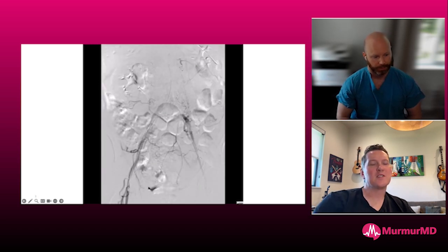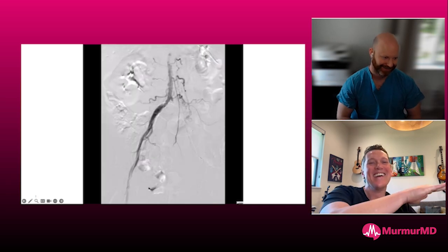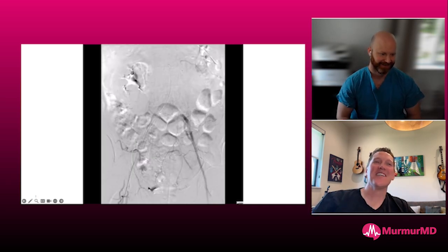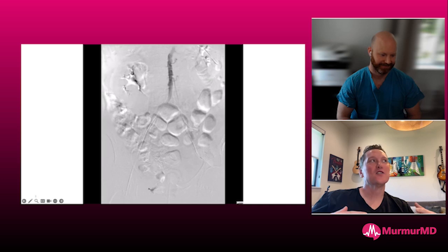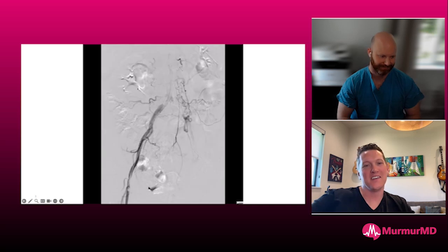Some people in total extremis, you put that thing in and it's like their heart's just like, all right, I'm done. I'm not going to pump anymore. And they go completely flat. And I'm like, oh, that's a really bad sign. I feel like those patients, you're probably going to have to leave the Impella in. I agree. Once the contractility just goes away the second you put it in, absolutely.